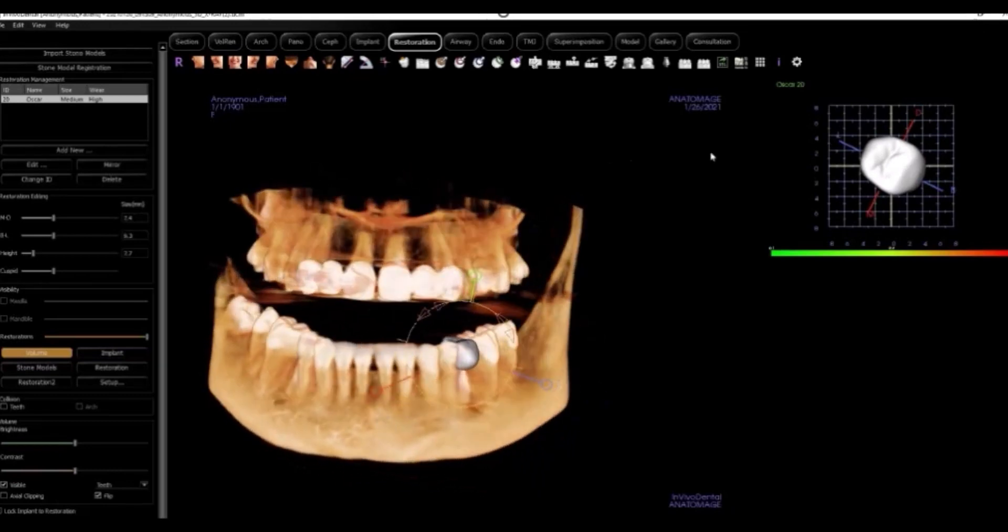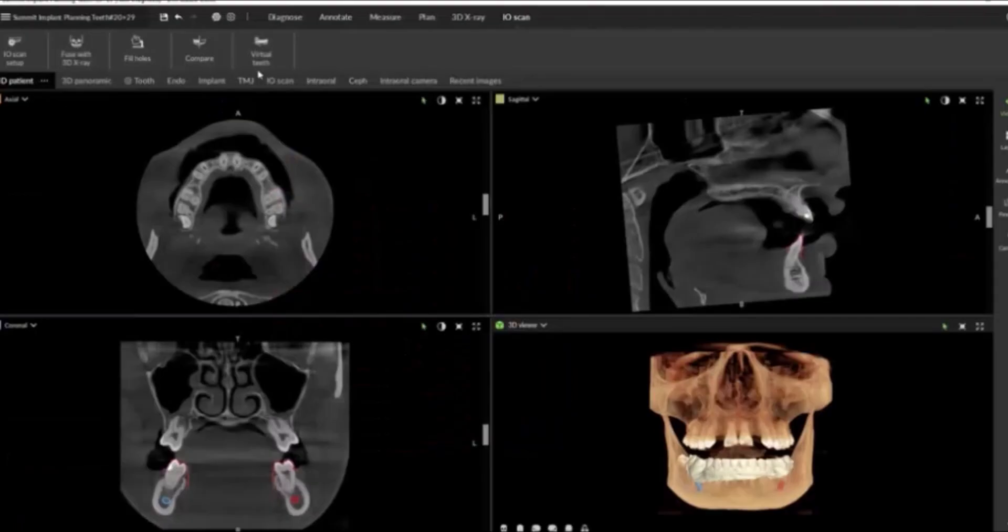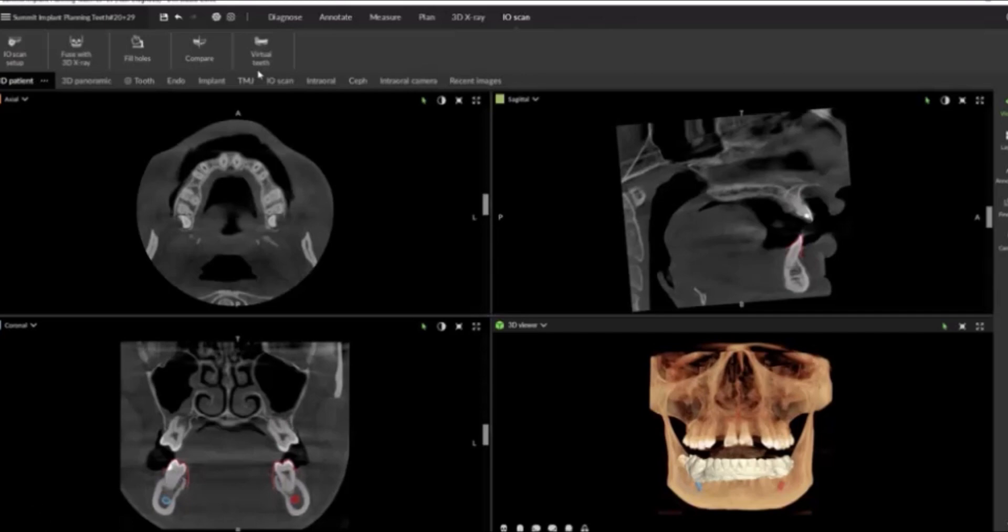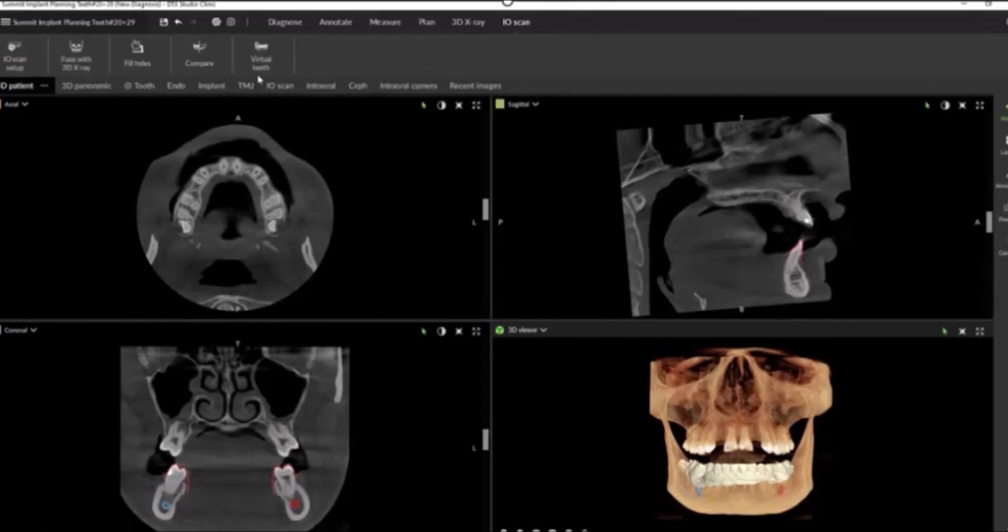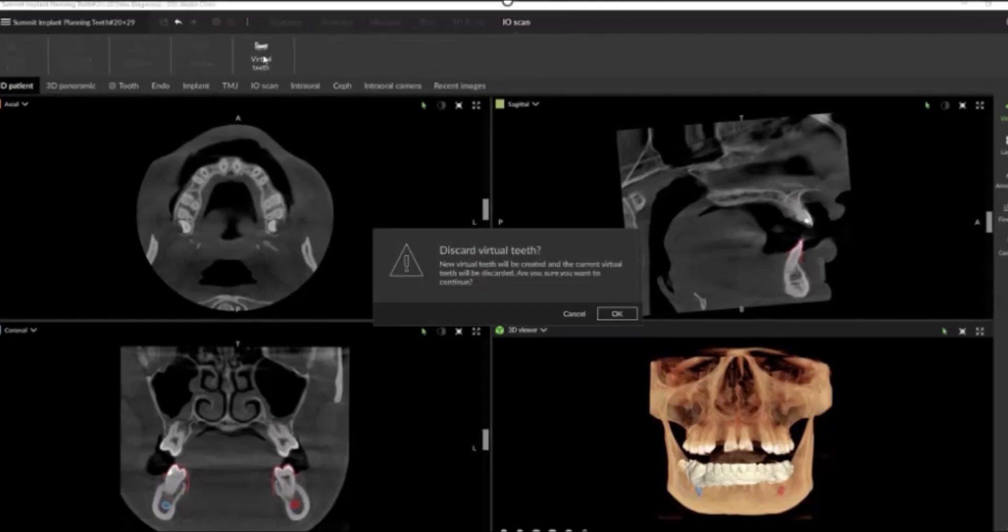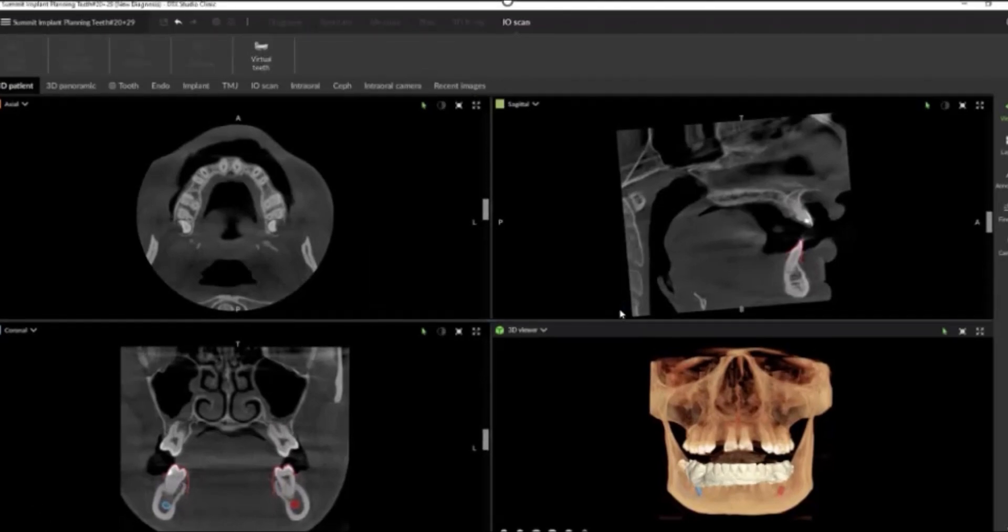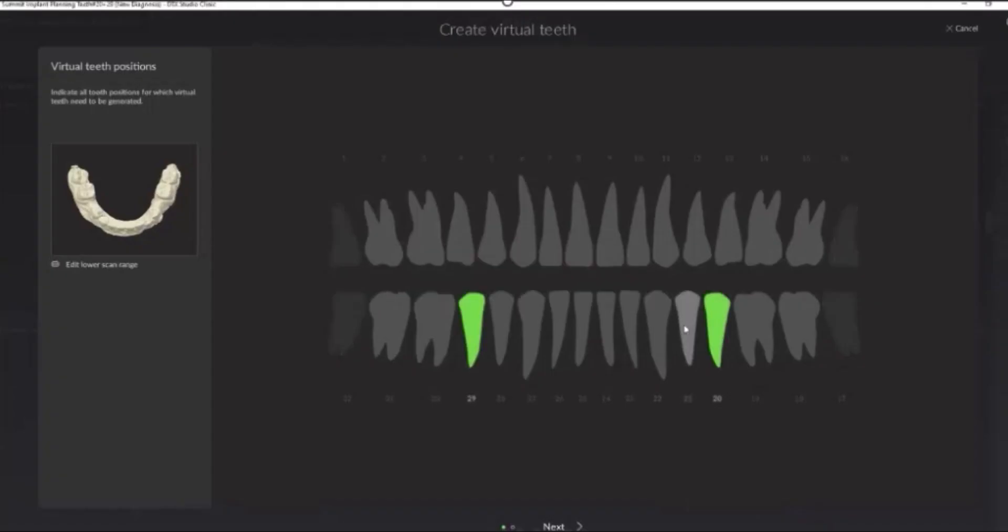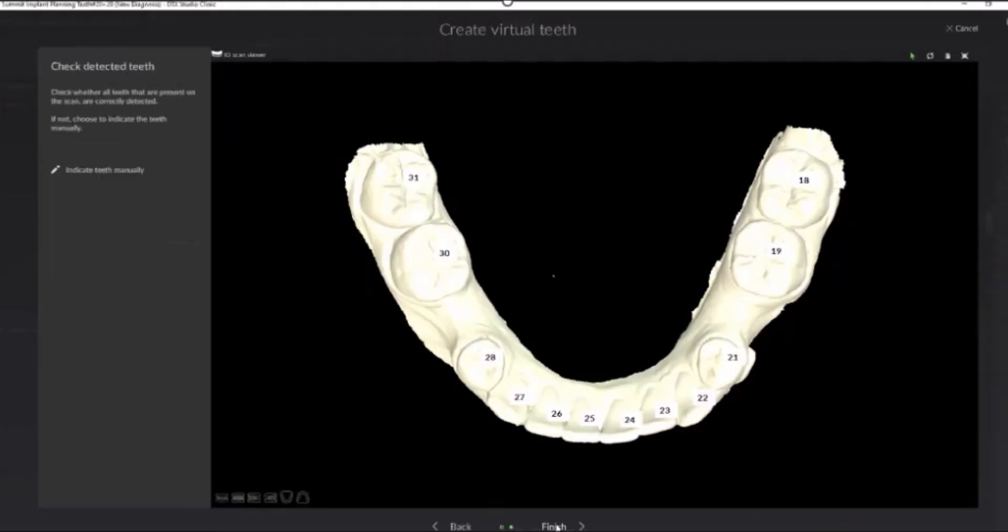Let's see how DTX Studio Clinic handles creating a restoration for crown down implant planning. All we do is select virtual tooth and now we watch our AI take over. First, it recognizes which teeth it needs to create. Then it tooth numbers every tooth in your scan using Magic Assist.